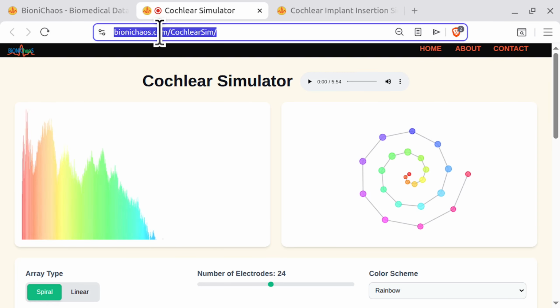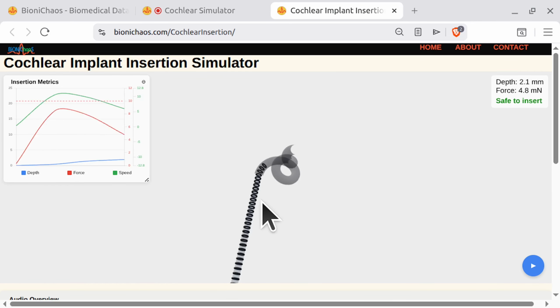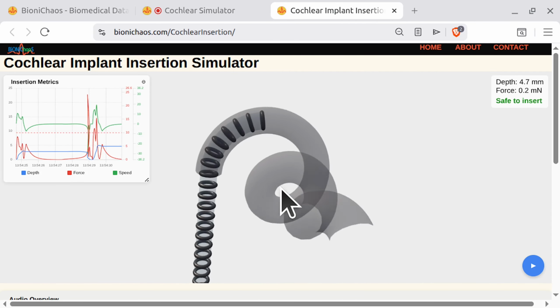We are looking at a permanent toll that includes sudden taste disturbances, violent vertigo, and the looming psychological threat that the machine embedded in your skull might just fail. It is an incredibly heavy trade-off. It's not some frictionless magical cure just because you vaccinated the meningitis risk away.